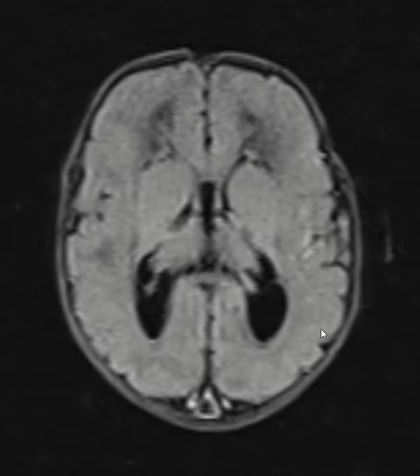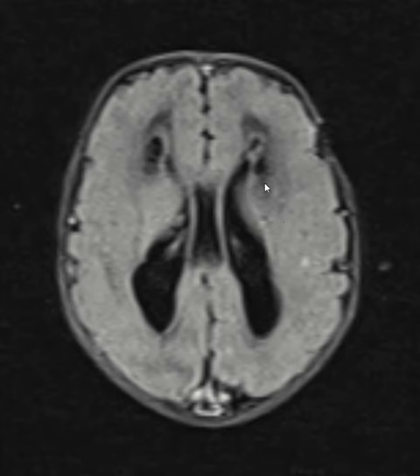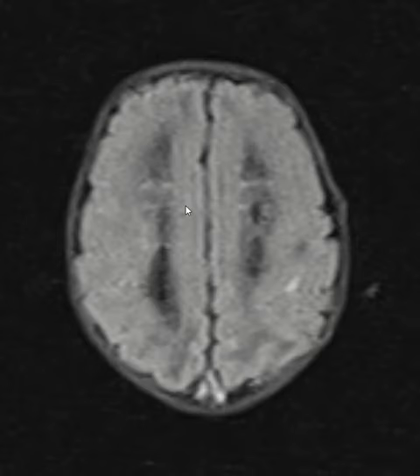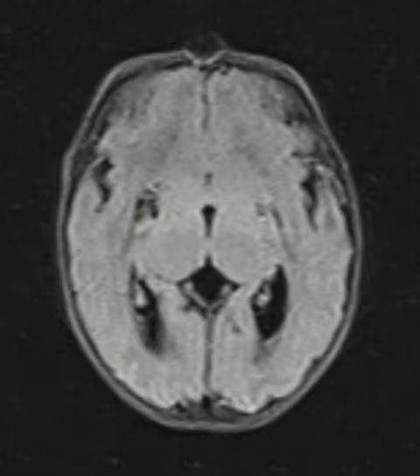The only good image was FLAIR, which picked out this cyst beautifully. There is also periventricular white matter sparing — the immediate periventricular white matter sparing which is described in CMV is also present. So yeah, let me know what you guys think. Thank you and have a nice day.